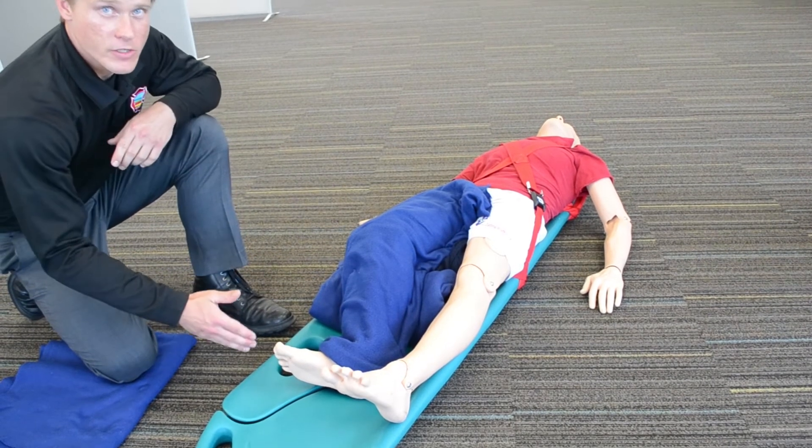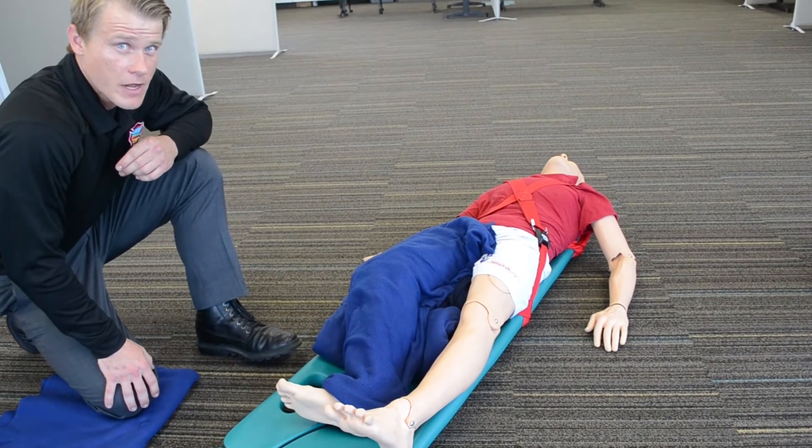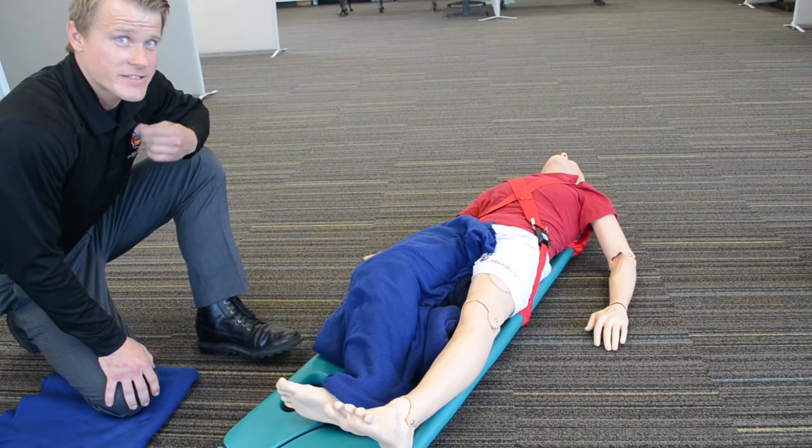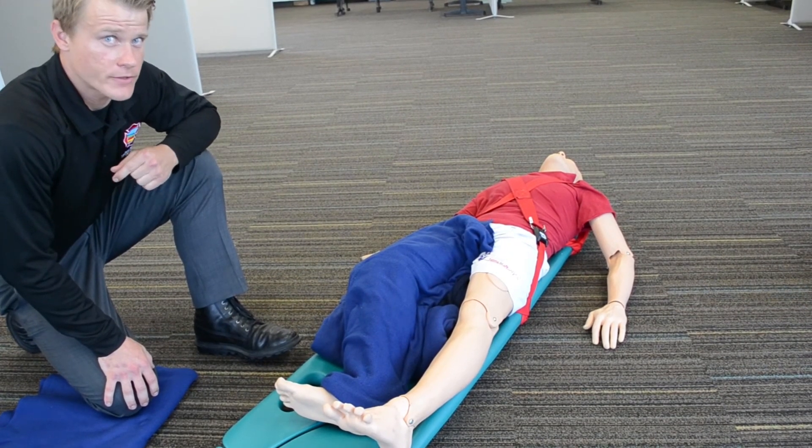Now that they're on the scoop stretcher, we can transfer them onto the gurney. We'll actually leave them on the scoop stretcher throughout the duration of the transport, so as to ease movement from our gurney to the hospital bed once we arrive at the appropriate facility.